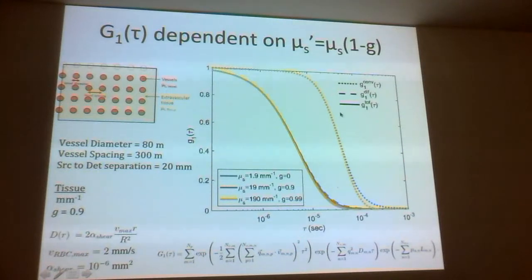We need to go measure that, right? But also, I think just intuitively, with OCT, you're going in and out of a vessel. You're really sensitive to that bulk movement, and what's going to cause a faster decorrelation is the linear displacement of the red blood cells, isn't it? So that's the one which creates that. For the OCT, yes, but in this realm, because we have more scattering events, it just enhances our sensitivity to the Brownian motion.